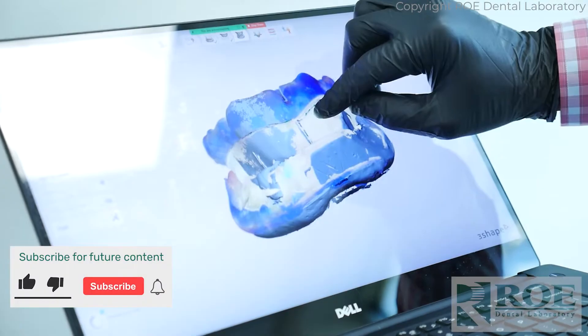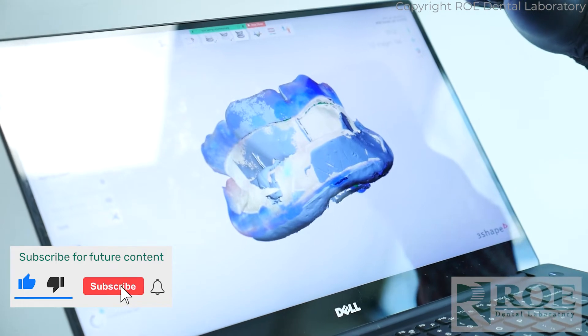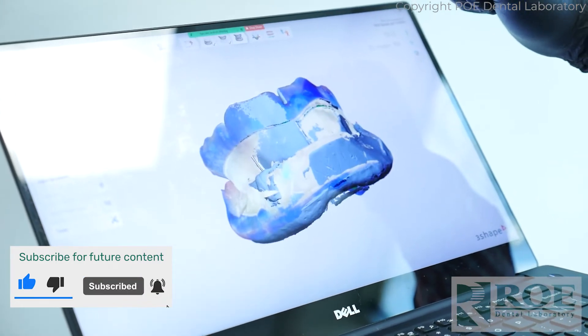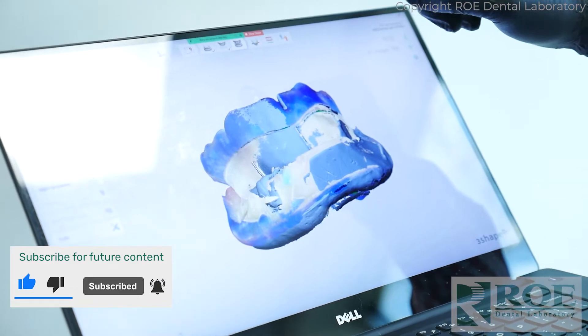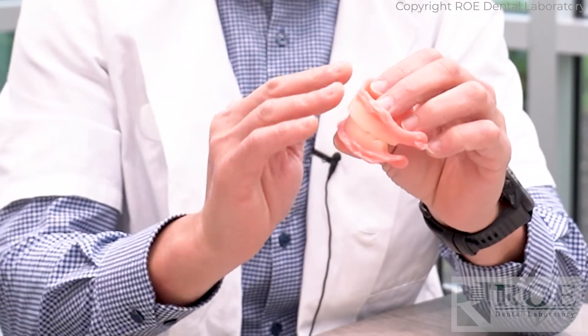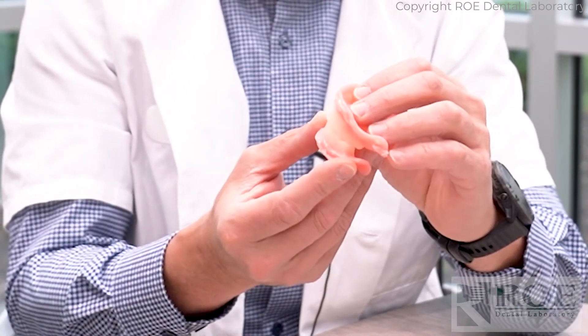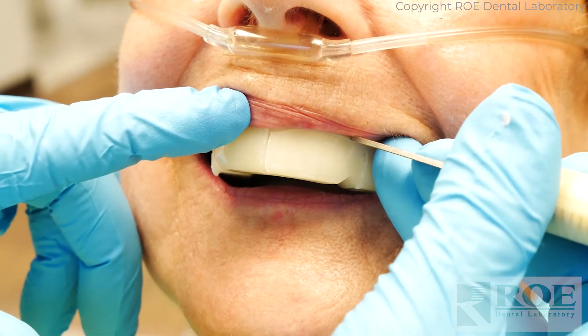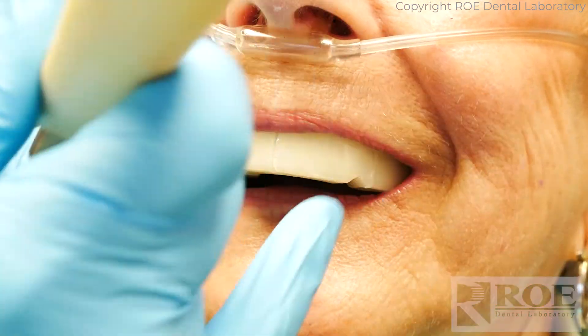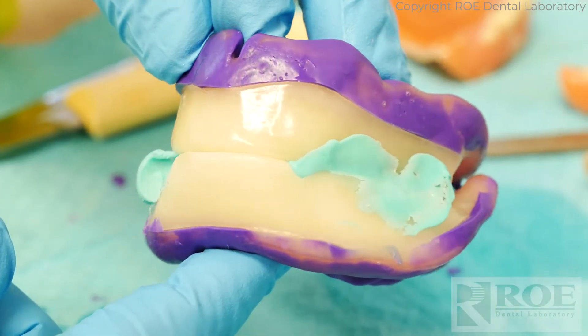Using digital technology to fabricate a denture from bite blocks. If you have an iOS scanner, you can simply receive bite blocks from our laboratory. It's a normal bite block appointment — adjusting the wax, making the marks for midline and high smile line, and making the notches for the bite registration.